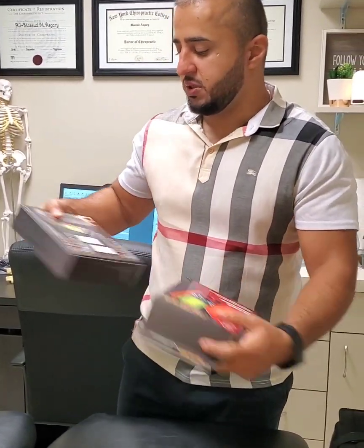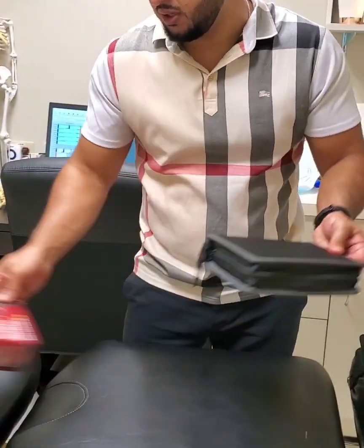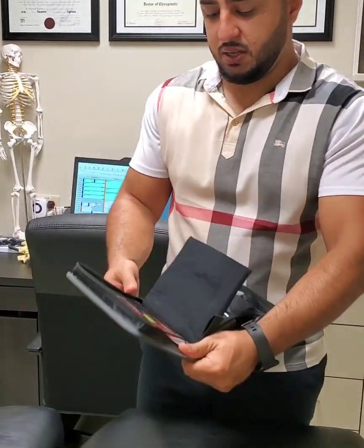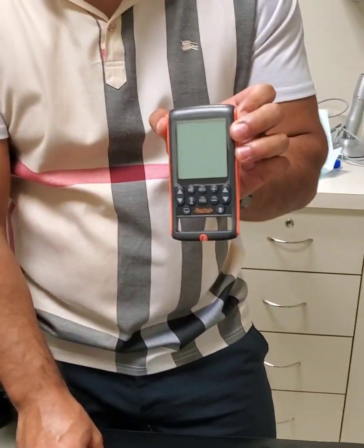First thing is you're going to open it up. When you open it up, it comes with a travel kit. Inside the travel kit, you will be having first the TENS machine itself.